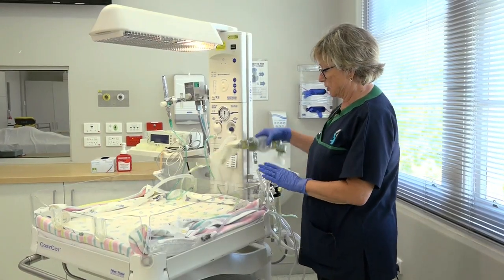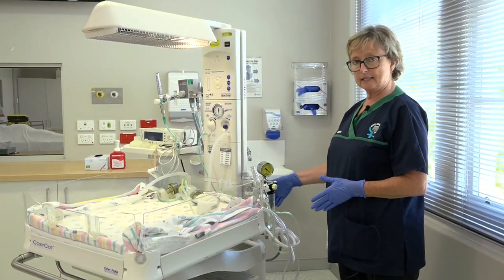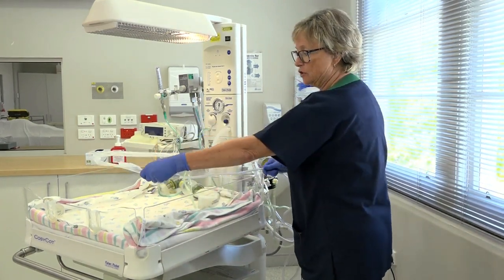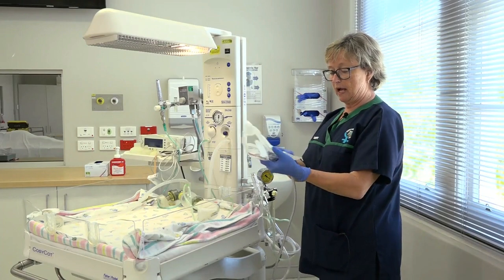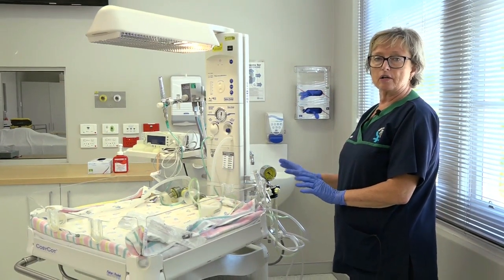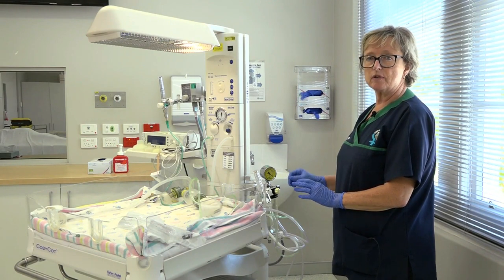Next, we need to check the suction. The suction is attached to the oxygen cylinder in this instance, or it could be on the wall, but the principle is the same. Make sure that there's enough tubing length to reach the baby and an appropriate wide-bore suction catheter. We use the straight suction catheter in this instance. The suction needs to be turned on, but not too strong — no more than 100 millimetres of mercury, probably 80 millimetres of mercury for a small baby.